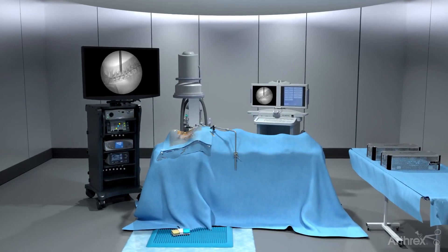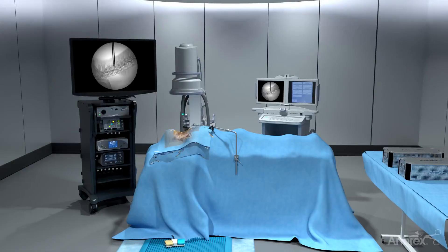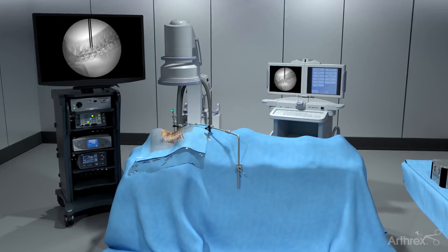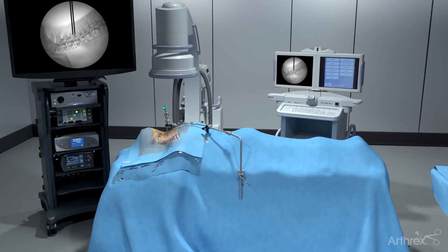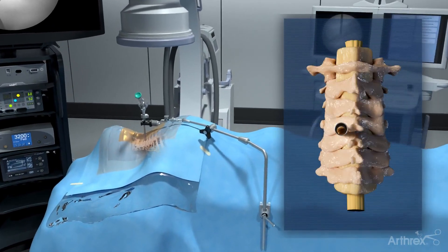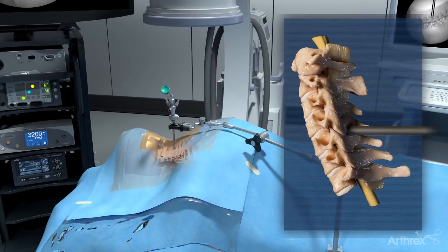Posterior cervical foraminotomy. The posterior cervical endoscopic foraminotomy approach from Arthrex is an ultra-minimally invasive surgery, ideal for patients who have been diagnosed with certain types of cervical stenosis. In this procedure, an endoscope is used to assist access and visualization.